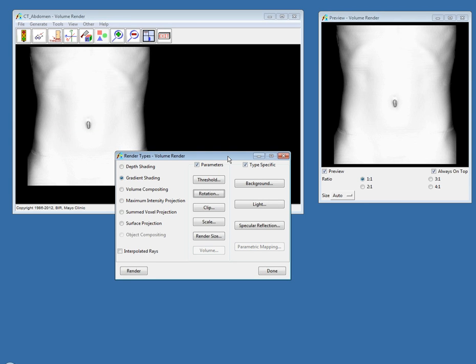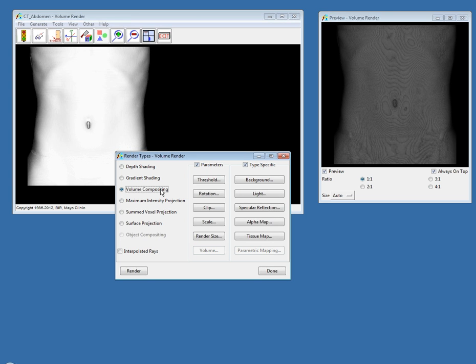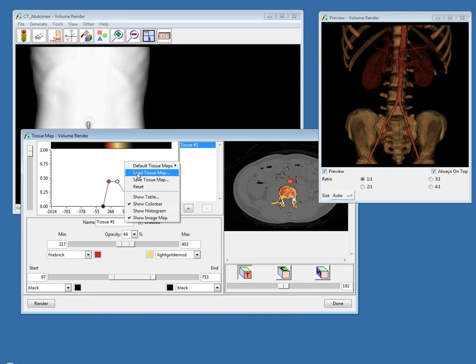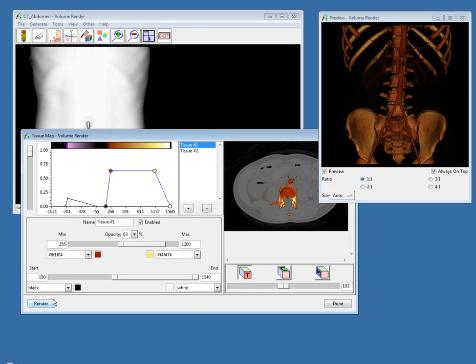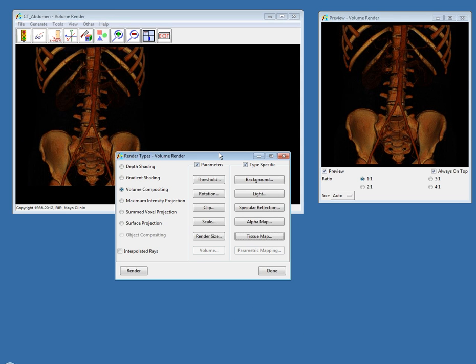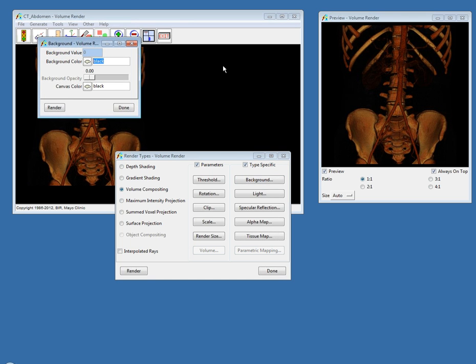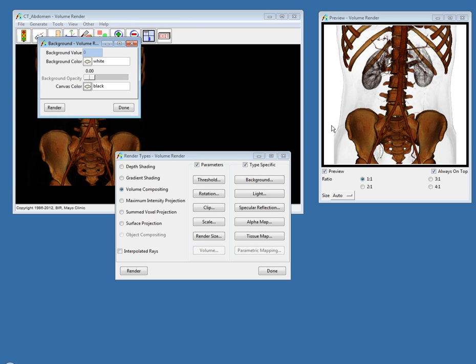Volume Render also includes new options for creating visually enhanced renderings using the Volume Compositing Render Type. I'll load a Tissue Map I created earlier and hit Render. One of the first ways to create visually enhanced renderings is with the Background Color option. I'm going to change the background color to white. With the white background, the tissue related to the skin in my Tissue Map shows up quite nicely, because in Analyze 11.0 the background color is composited directly into the rendering.